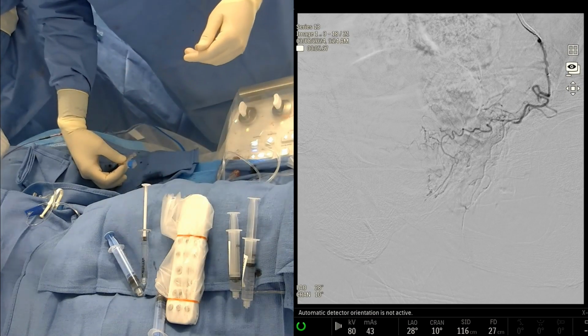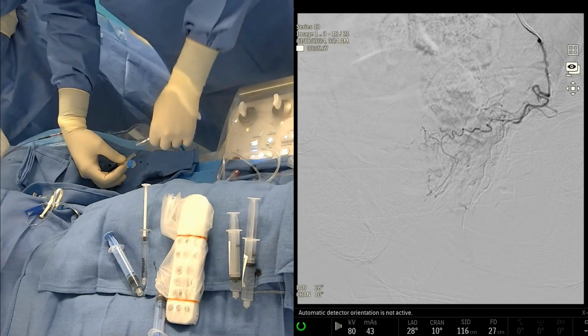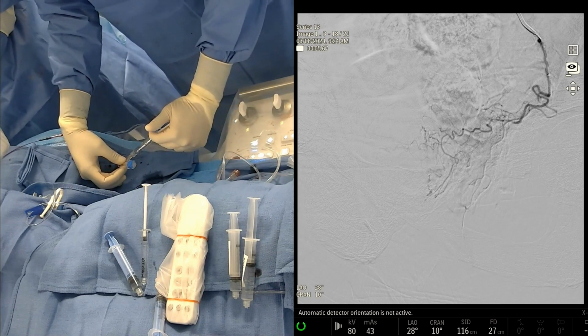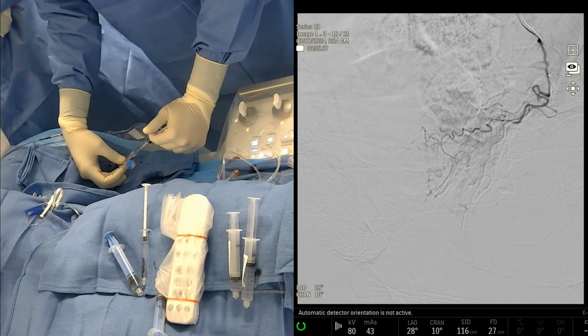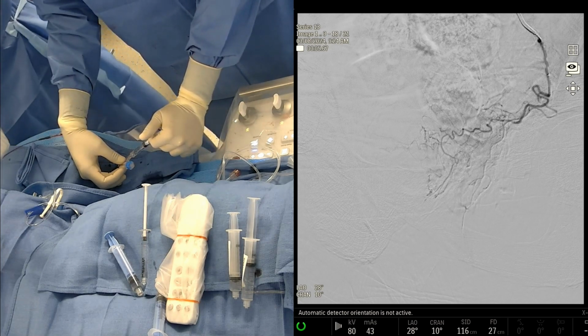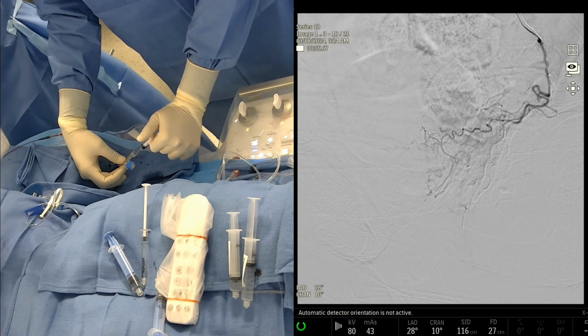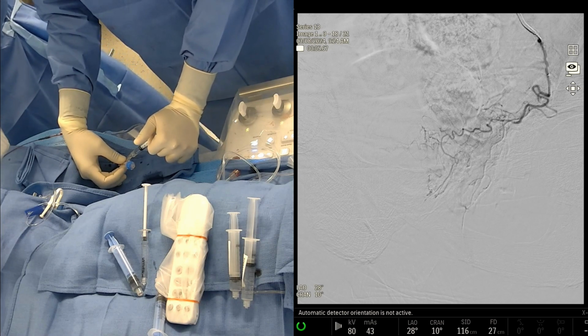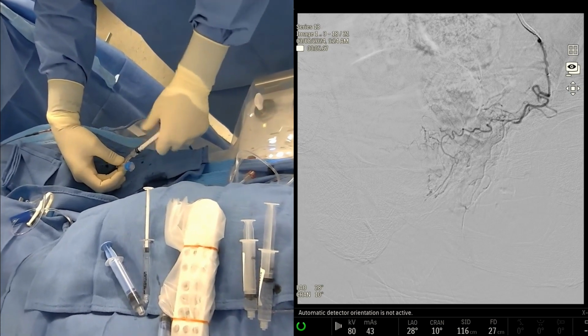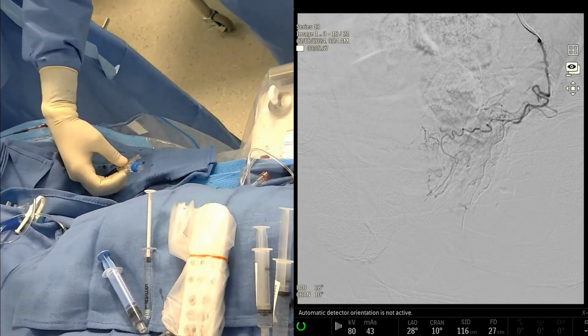Yes, but I agree with you, Viv. We should go distal. You can see that prostate artery pretty well here, and you can see the middle lobe pretty well too. We'll get a better picture. But if you look closely at this angio, you'll see these little spidery branches that are going north. That's the median lobe vascular supply. And so we really want to try to get embolic into that spot, but we'll see.